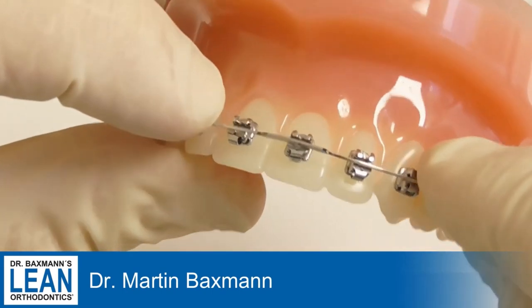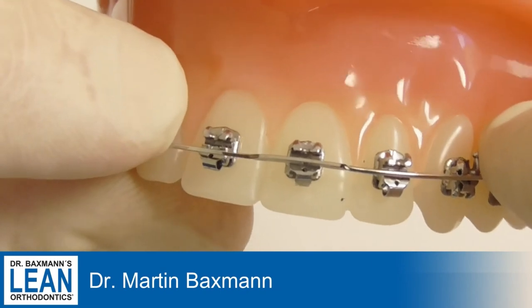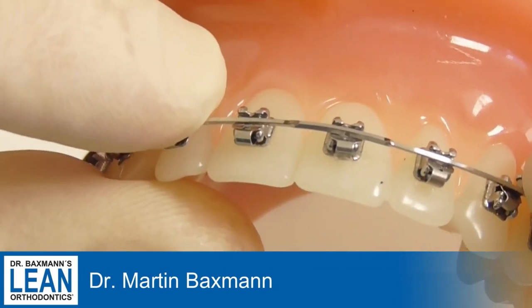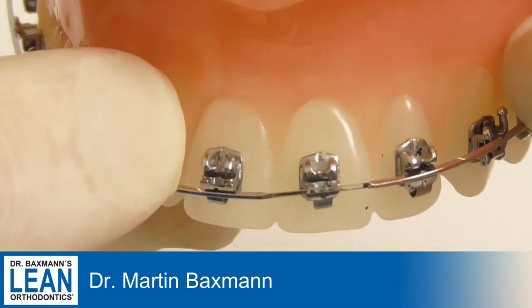So try it out. You need to practice it and then insert it in the bracket — no matter if it's self-ligating or ligating or whatever. Have fun.